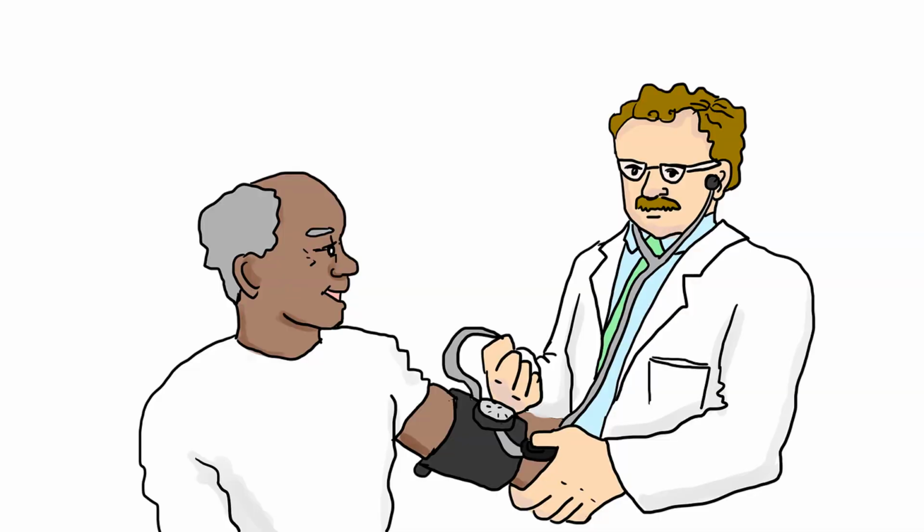Care should be taken to avoid too tight or too loose application of the cuff. The person should be resting comfortably for some time before the measurement. Average of multiple readings gives a better assessment.